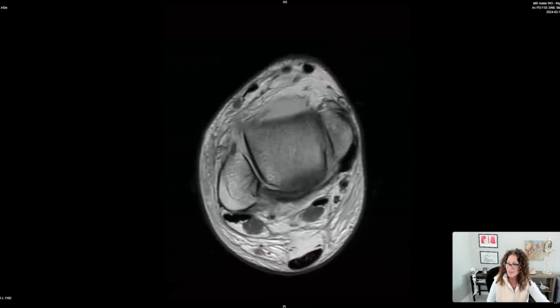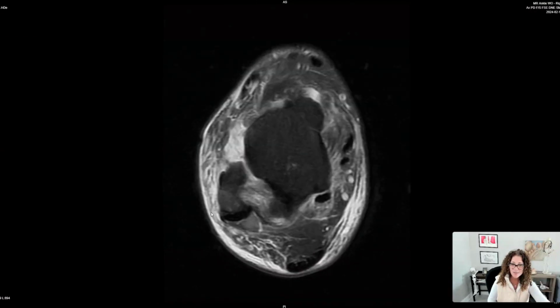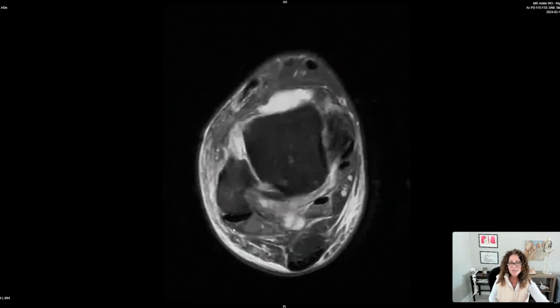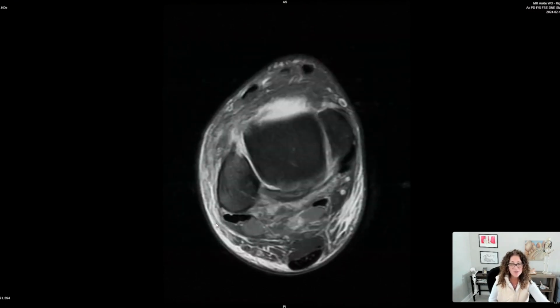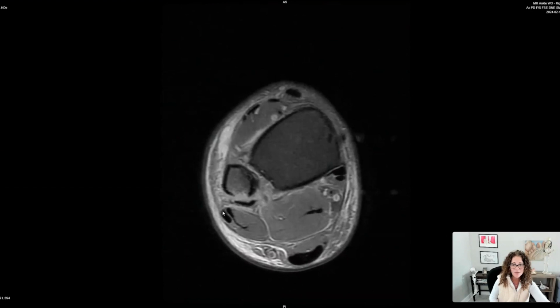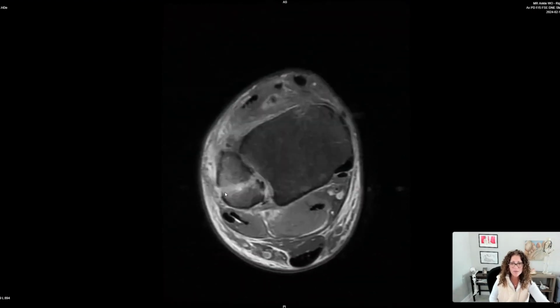Superior peroneal retinaculum itself, I want to get to my proton density because I really want to understand that this is irregular and sprained with edema. So it may have subluxed, and there is maybe a small pouch. One thing I can use to work that out would be dynamic testing with ultrasound. I can place my transducer here, ask the patient to point their great toe down and out, and that will evert. And if there is a propensity for these guys to sublux, they'll sublux. But I can see that there is some tear of the superior peroneal retinaculum as it attaches on the fibula. Of course, we see the fracture. We're going to avoid that for now.